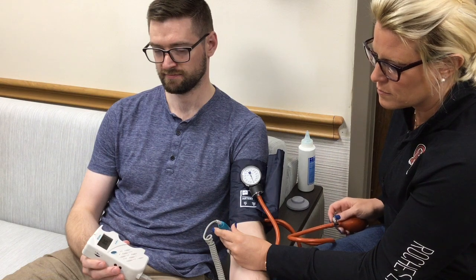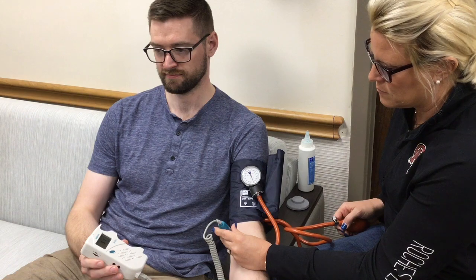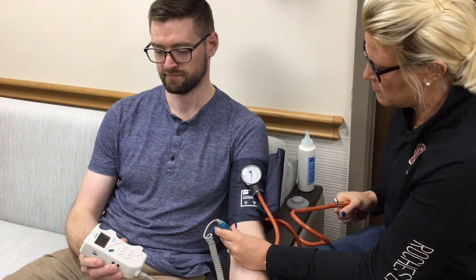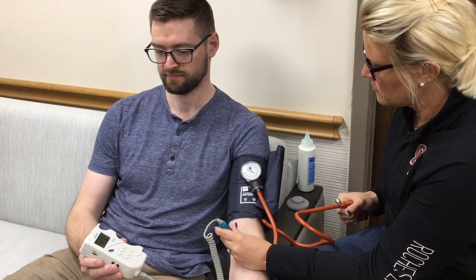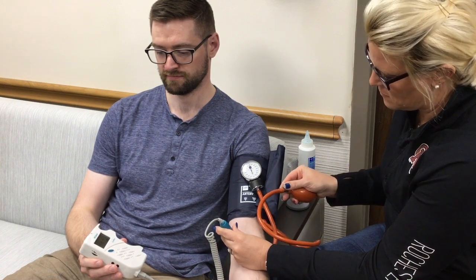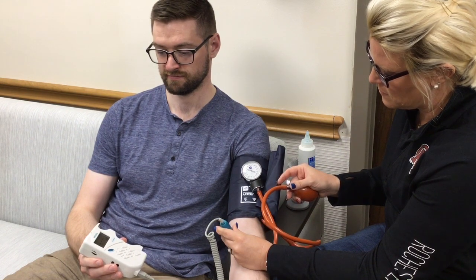Next, while holding the Doppler in place over the pulse, inflate the cuff until you can no longer hear the pulse. Now slowly deflate the cuff by turning the knob on the blood pressure cuff slowly, and listen for the return of the pulse sound.